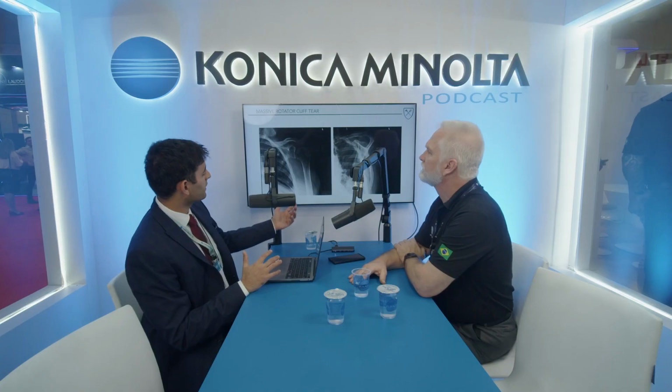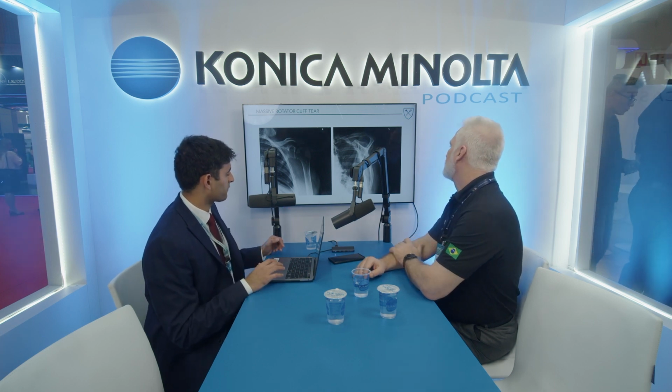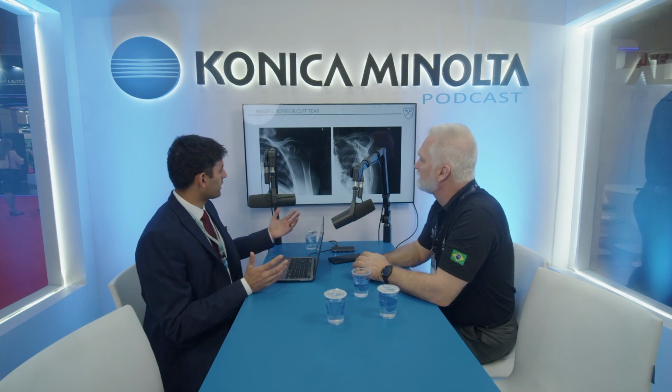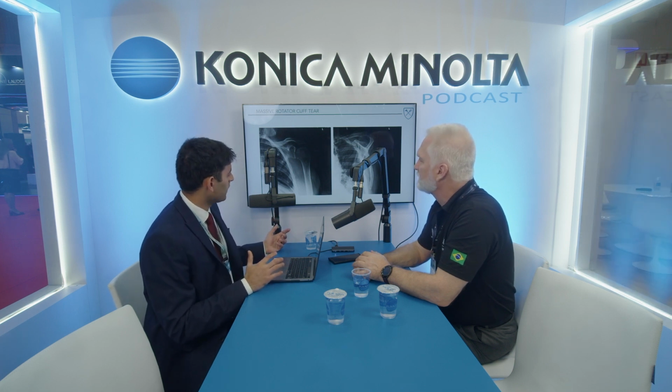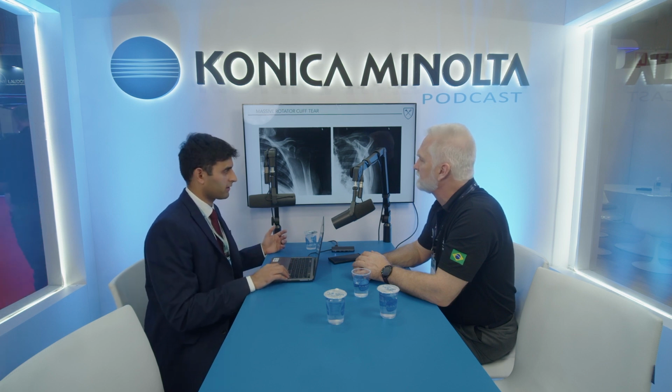What about massive rotator cuff tears? This is a problem where typically patients need a lot of workup. They need examination, imaging, MRIs, expensive workups to really understand what's going on. A static X-ray may look like this. The patient has a massive rotator cuff tear, which was MRI confirmed. But on the X-ray, it actually looks like a relatively benign image. The shoulder is well reduced. It's appropriately located in the glenoid.